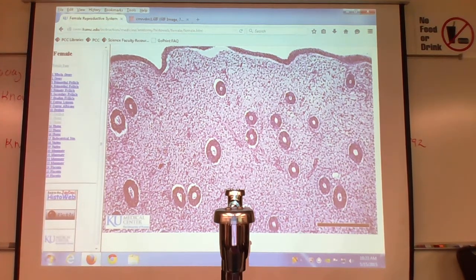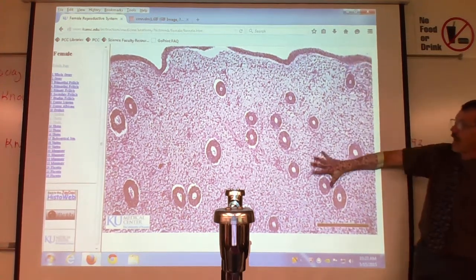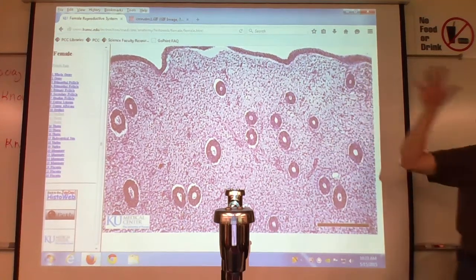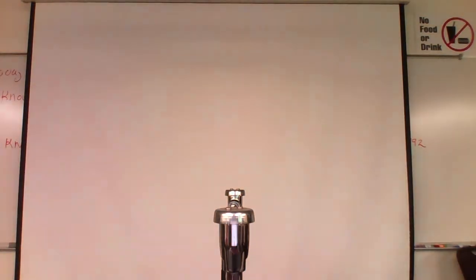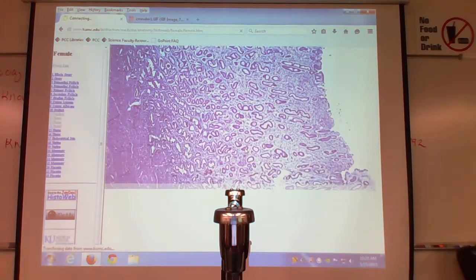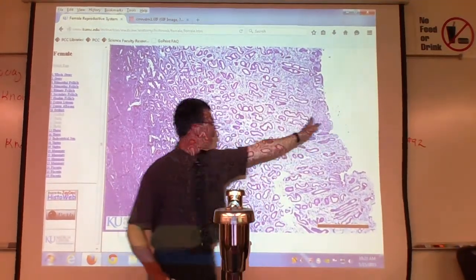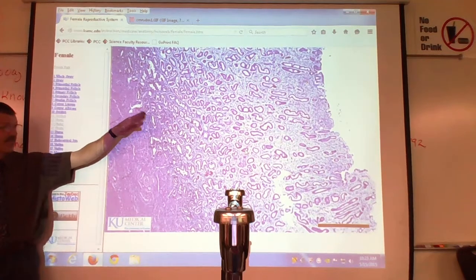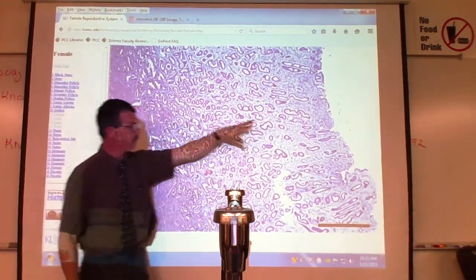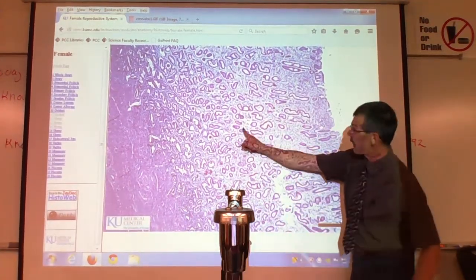That's the innermost or superficial layer. So the baby lives up at the top. So this is endo, within the uterus, but that's the functional where the baby's going to be. Wait, so did you say the functional is the myometrium? So let me show you. This is a better view because it shows all the way down. So baby lives here. From here to about here, that's all the part touching the baby. That's the endometrium. That's the inside of your uterus. So the functional layer is the part that sloughs off, which is about here up.